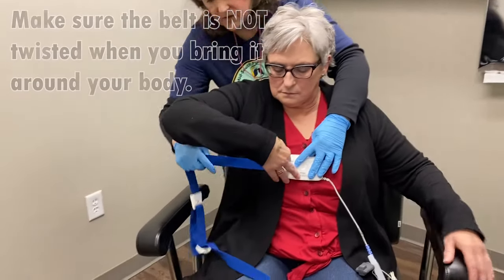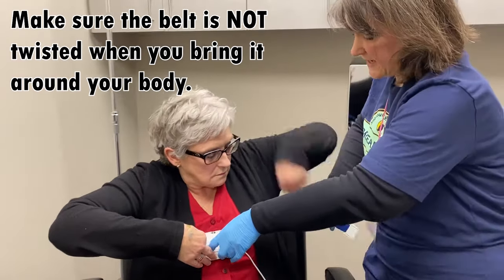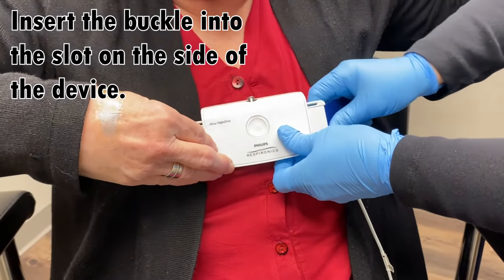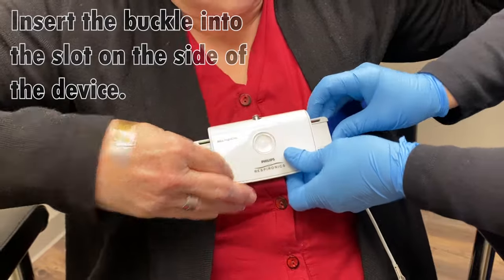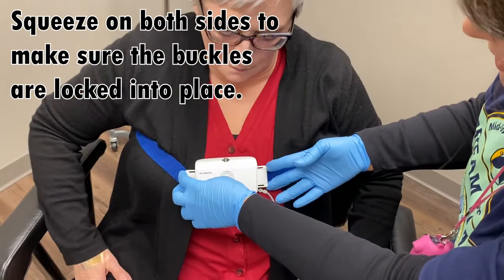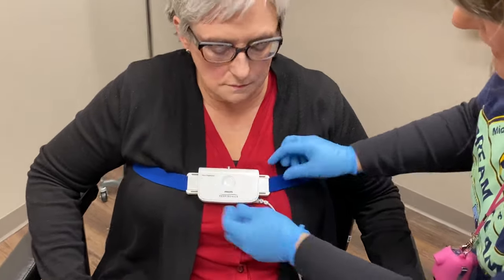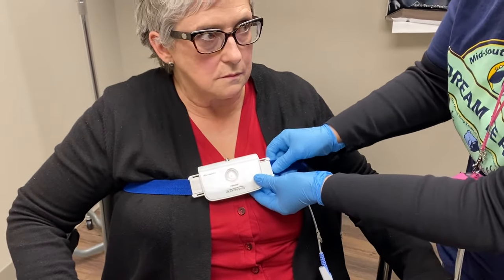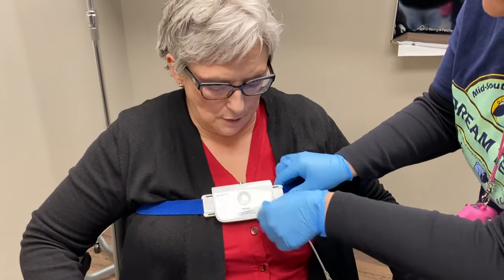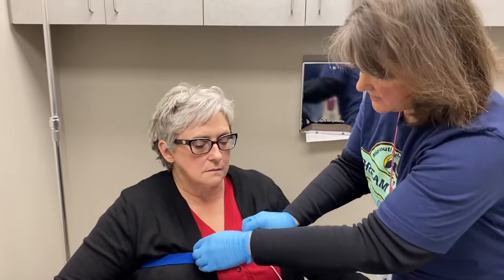Then you're going to bring the belt around — make sure the belt's not twisted because it can possibly affect the way it plugs in on the other side. Insert that buckle into the slot and make sure it snaps all the way into place, both top and bottom. Squeeze on the sides to make sure it's good and locked. You don't want the belt too tight; if it's too tight it might become detached while you're moving around in the bed. You want it to be somewhat snug so it picks up on respiratory movement, but not too tight.